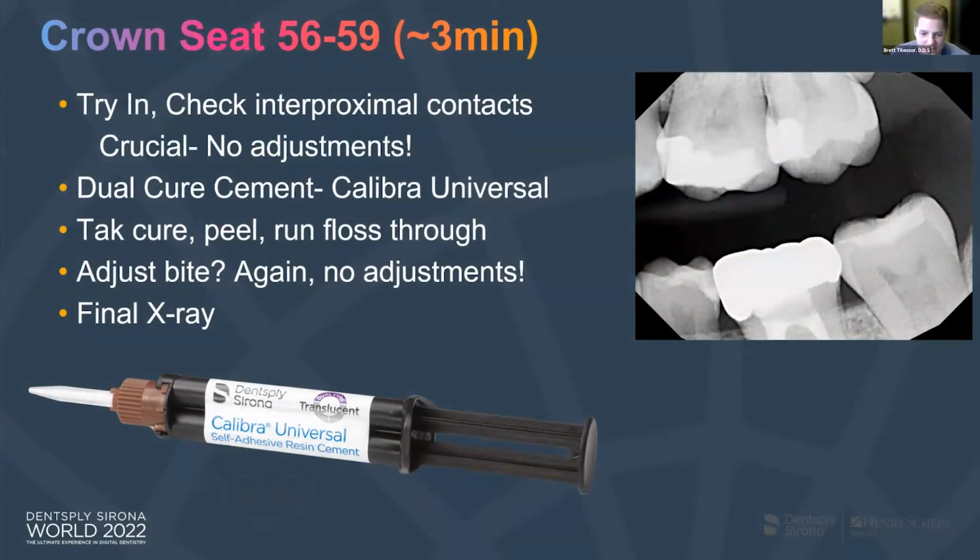If you've all gone well and you've really gave it a good prep and you followed these tips, this should fit perfect. Very, very few times do I ever have to adjust these. I very, very seldom adjust the interproximal contacts. I very seldom adjust the occlusion. Anytime you take a burr or zirconia, there's a chance of introducing microfractures. So you really want to get this down to where these seat, and I tell you, patients love it.